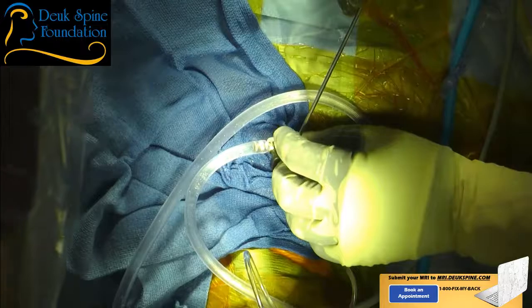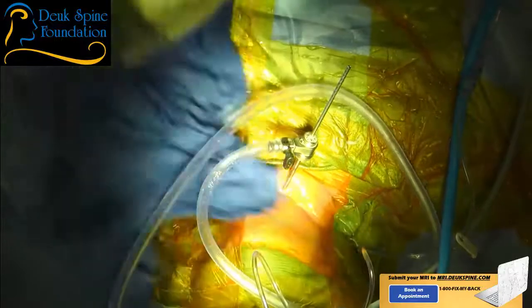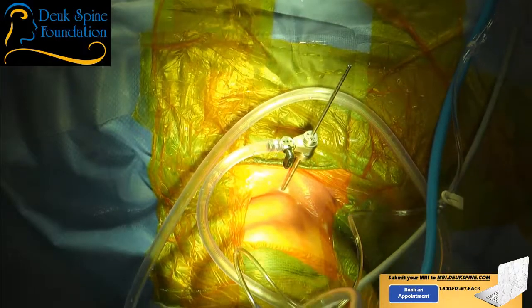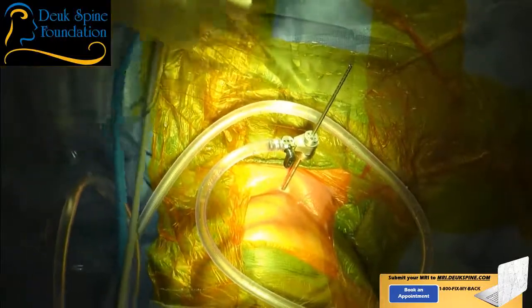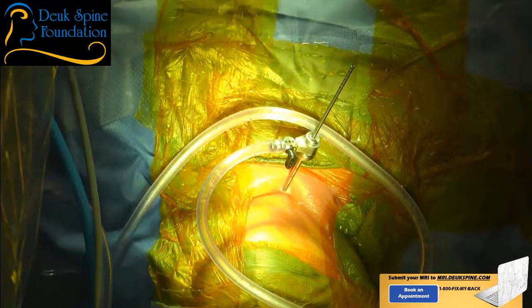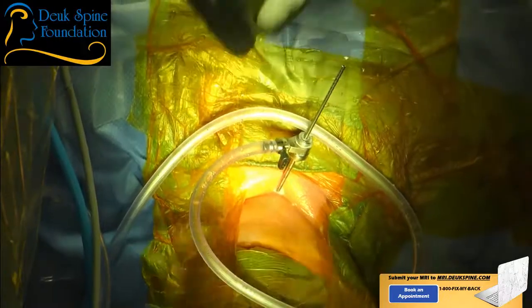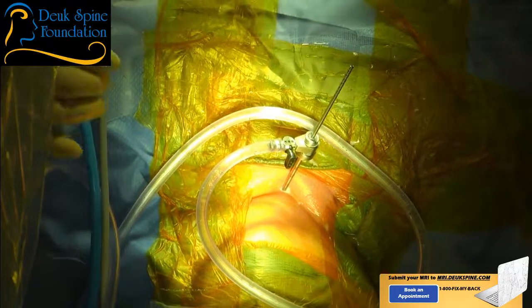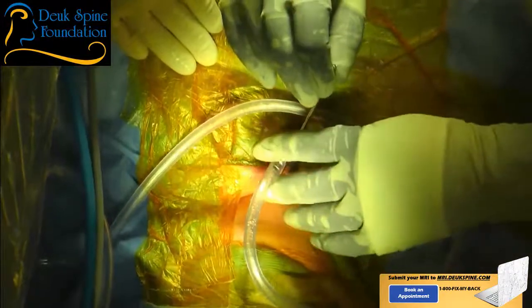Okay, good. All right, so at this point, we finished the first disc, and now we're going to do the next one. I'm going to try to get down to 6-7, so I'm going to need some help from everybody. How's her muscle relaxation at this point? Good? I'll give her a second dose. So it's good. What I'll ask you to do is just some inline traction, distraction. Just hold her neutral and pull a little bit. Not much, just gentle. Then we're going to pull the shoulders down with Luis's help. And then I'm going to try to move this dilator south to 6-7. Okay? And if I can succeed at doing that, great.